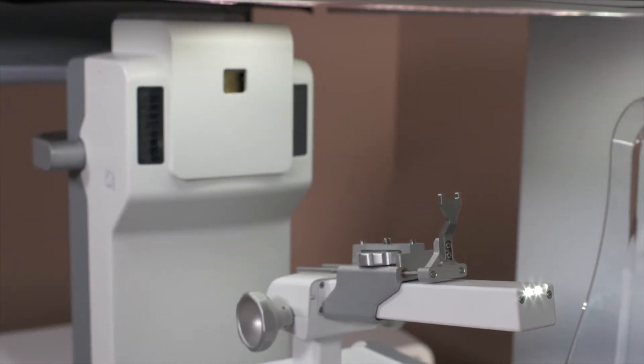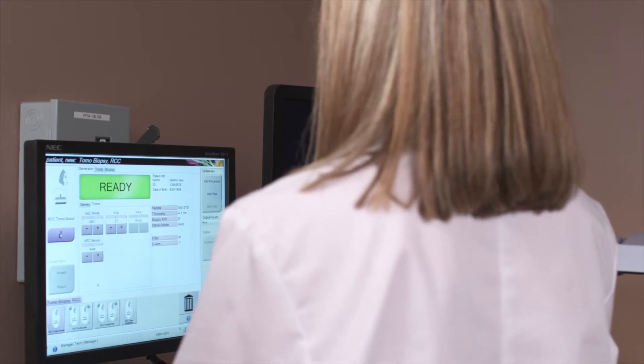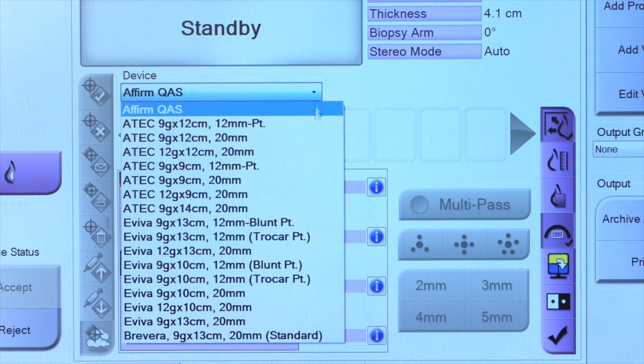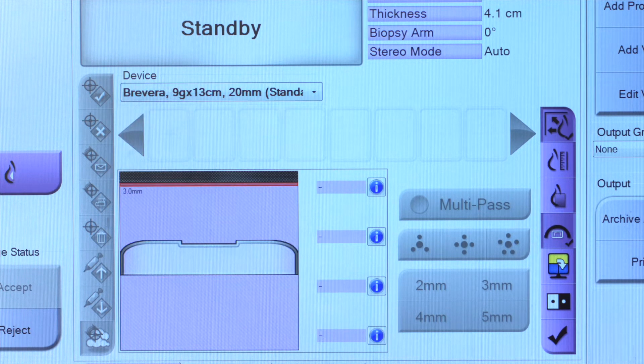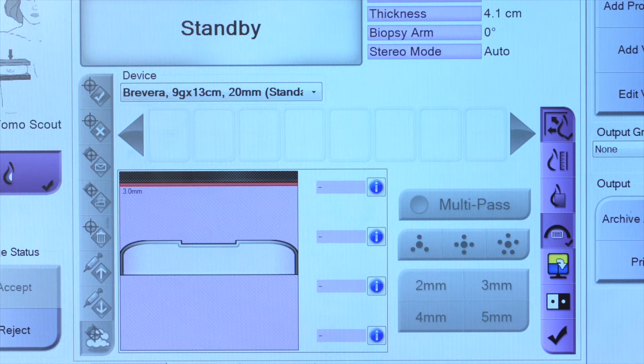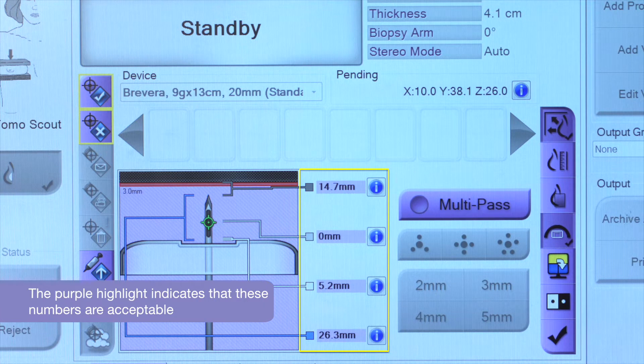On the Affirm Prone Biopsy System, a stereo pair or TomoScout may be taken. The Brevera breast biopsy device is chosen from the list programmed on the acquisition workstation. The system will use the selected device to calculate all safety margins during the procedure.